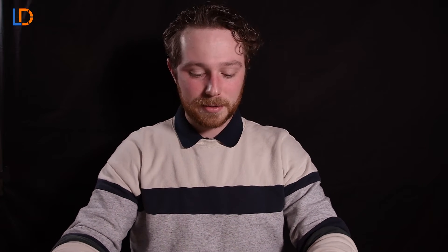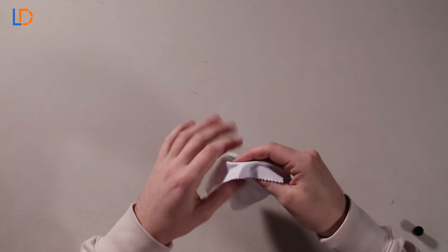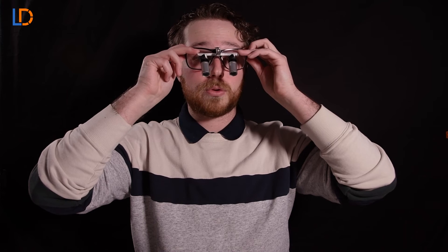Now once you don't see any shading on the left or right side of the oculars, it's time to adjust the working distance. To adjust for this you're going to want to put on your loops and grab a target object. For me I'm just using this little white cloth — works great. So you're going to want to lay that out and find the target object through your oculars.